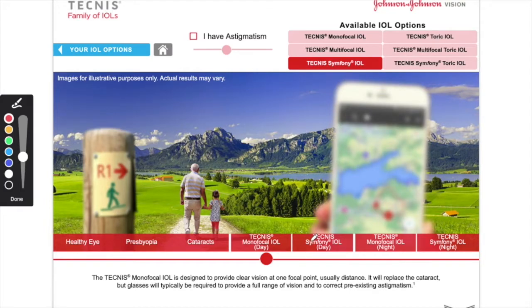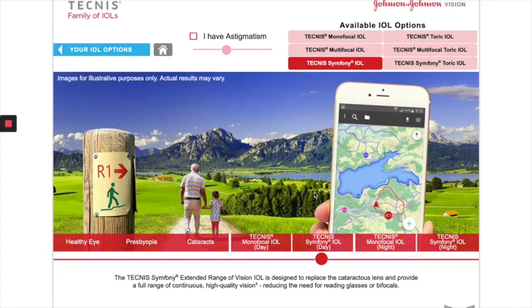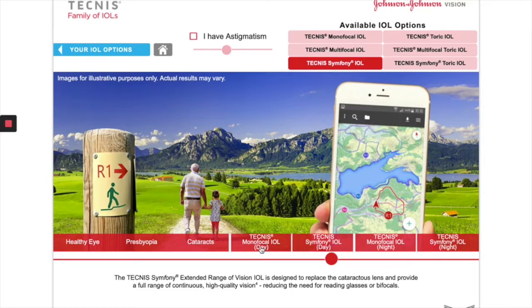However, if you are interested in getting rid of your glasses and you would want to see most of the day walking around with no glasses, then we could consider the extended range lenses. So just compare these. Let's look at the phone, focus on the phone now. And if you put the extended range one, you see how now everything is in focus. So you do see up close your phone, shaving, makeup, everything clear. Intermediate, computer, laptop, crisp, and distance, everything is in good view. So again, compare the regular lens with an extended range lens. Regular lens, extended range lens.